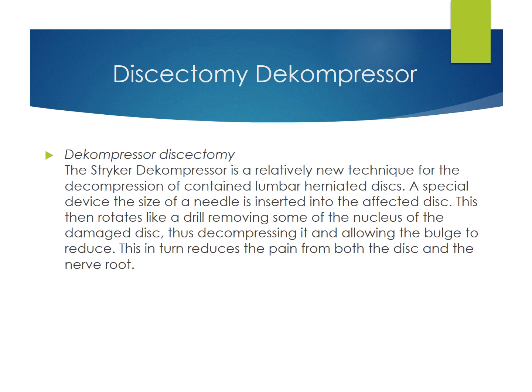Discectomy. The decompressor is a relatively new technique for decompression of contained lumbar herniated discs. A special device the size of a needle is inserted into the affected disc. This then rotates like a drill, removing some of the nucleus of the damaged disc, thus decompressing it and allowing the bulge to reduce. This in turn reduces the pain from both the disc and the nerve root.